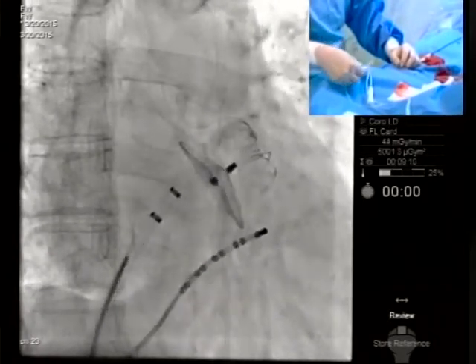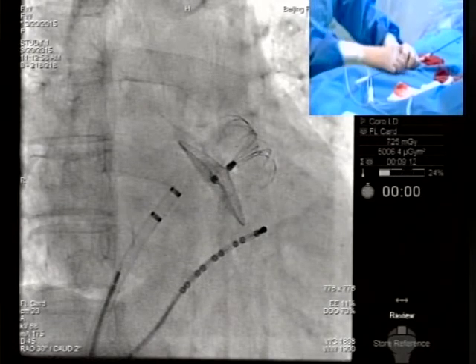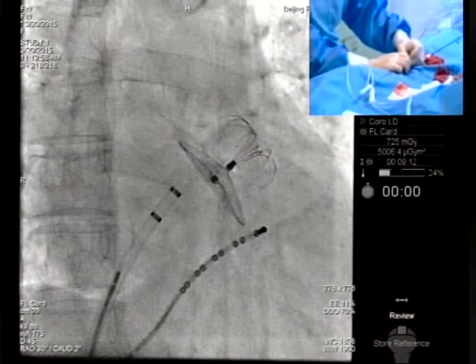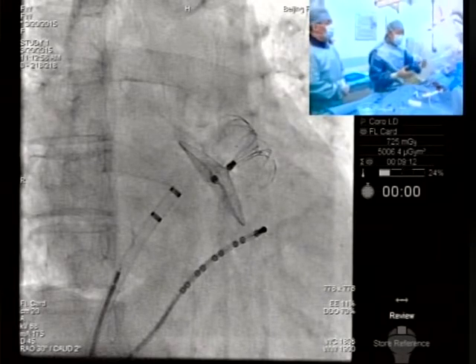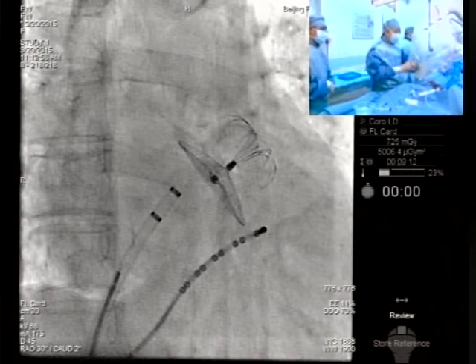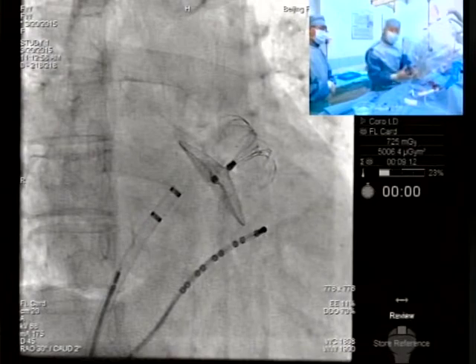And this is the second early remodeling. In the moment of release of the device, very often the three-dimensional constellation changes because having lost the contact of the delivery cable, the appendage snaps back to its anatomical position.